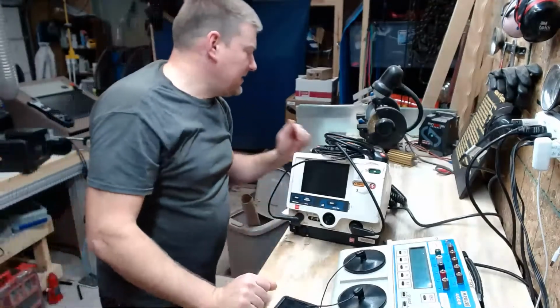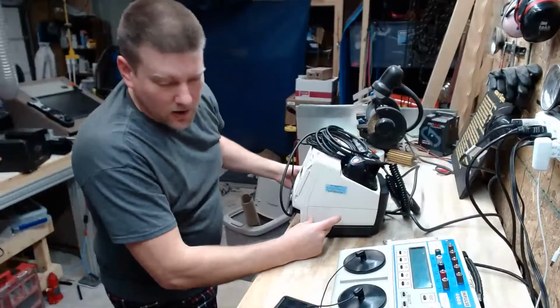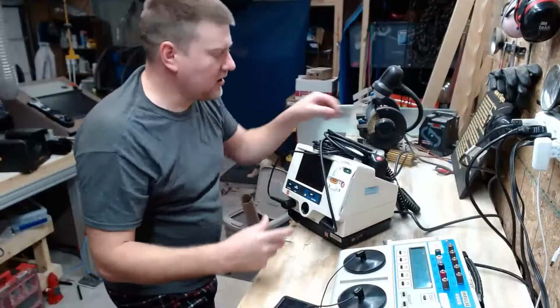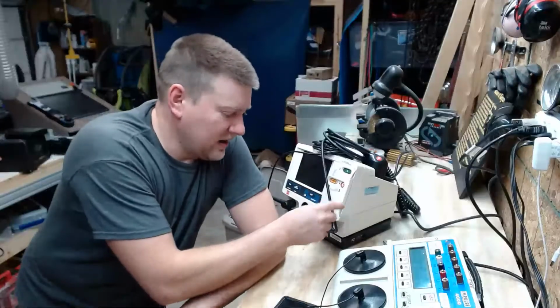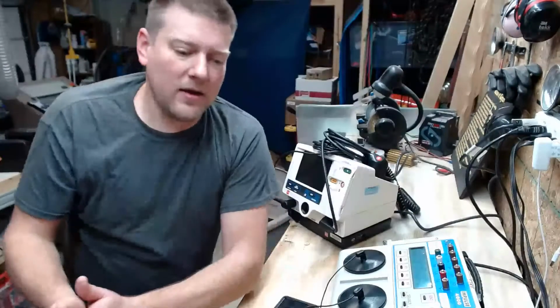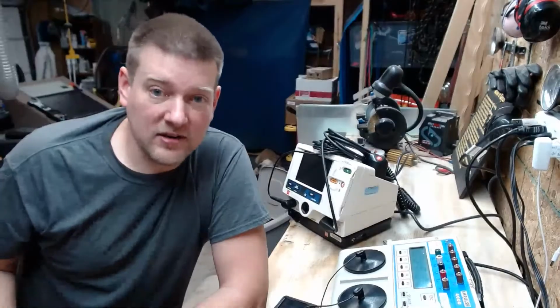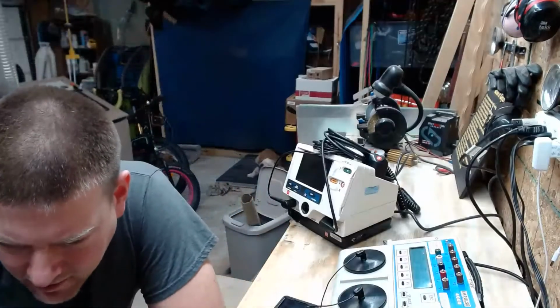Now, the only other thing I didn't cover, guys, is the internal diagnostics with these things, which there is a test load on the Zolls. With these ones, there's a little shorting plug that you put on the end, and you do a 30 joule discharge, and it tests the integrity of the cord and the measurement electronics and stuff. I'm not really going to go into that. That's in your service manual and your user manual. The users should all know how to do that test, and they do. Your nursing educator should know inside and out how to run that test. So I covered that there.